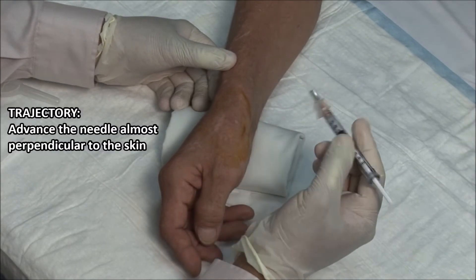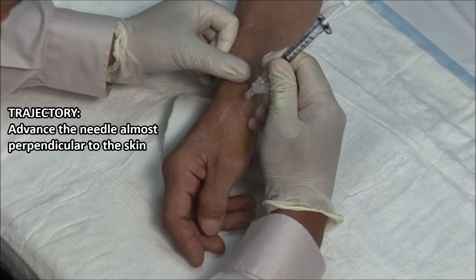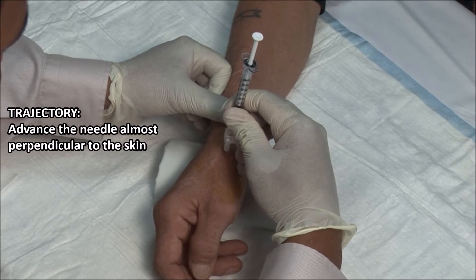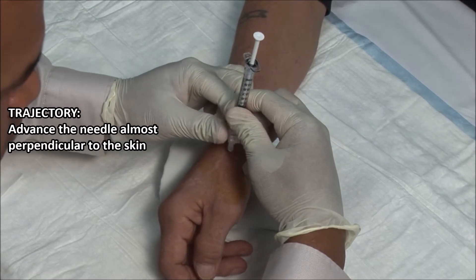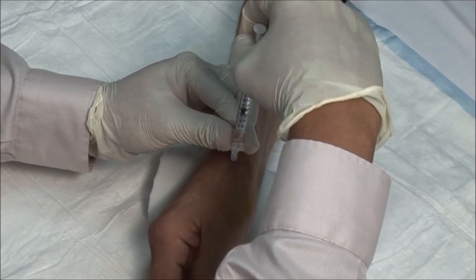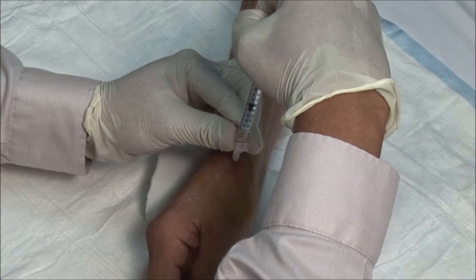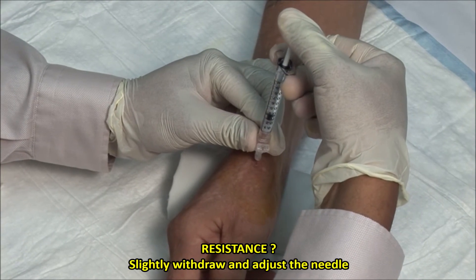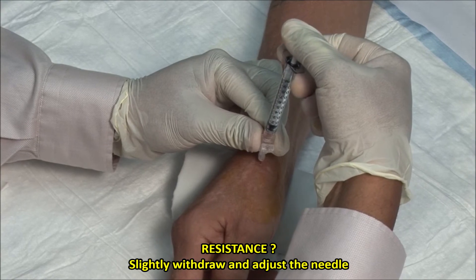Advance the needle vertically into the joint space. Aspirate to ensure that you are not in a blood vessel, and then inject the solution. It should go in fairly freely.